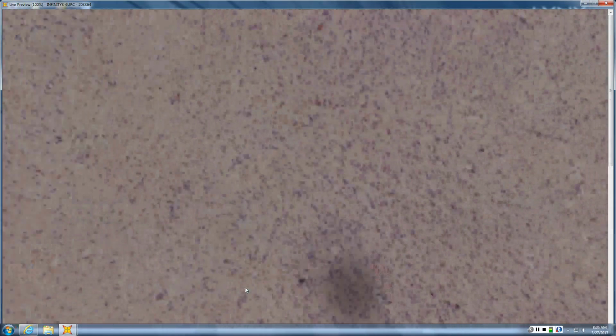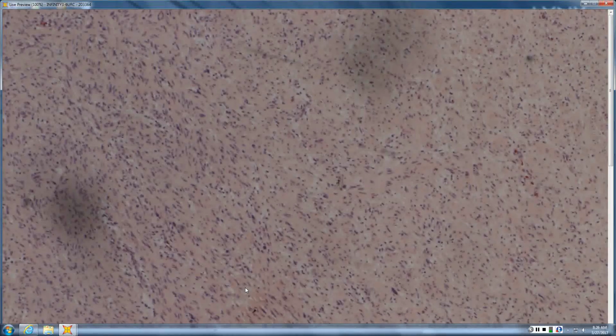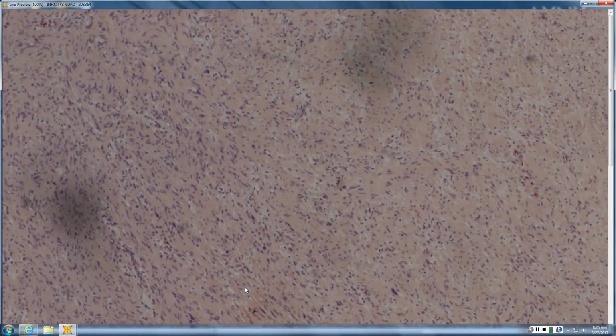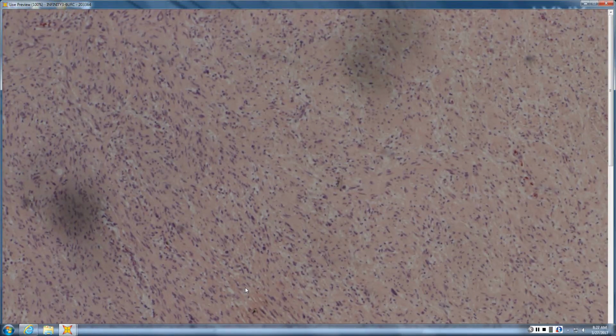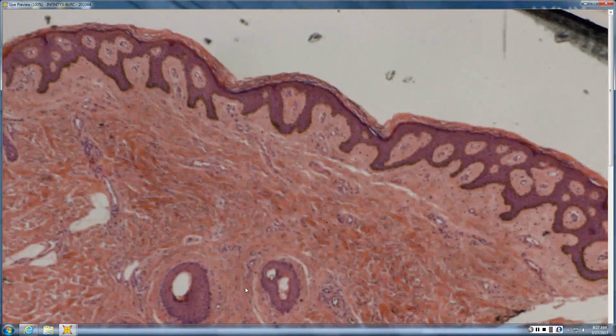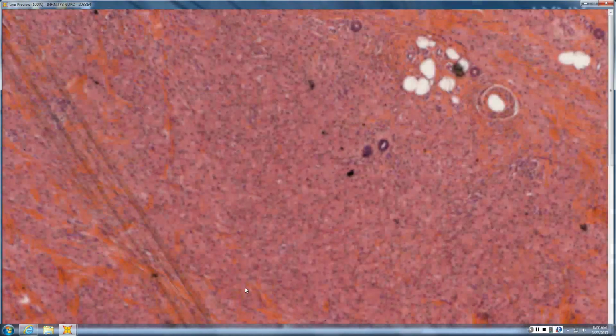Like a neurofibroma. Some areas that are a little denser, a little looser, but overall loose, myxoid, wavy, jumping dolphin cells. But I do see some larger hyperchromatic cells in there. Should I be worried? I don't think so. Okay, in the absence of mitoses or hypercellularity, the atypia doesn't mean much. Okay, let's see what else we got to hit here. So that's the skin.